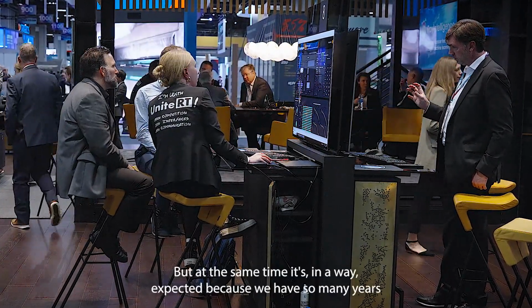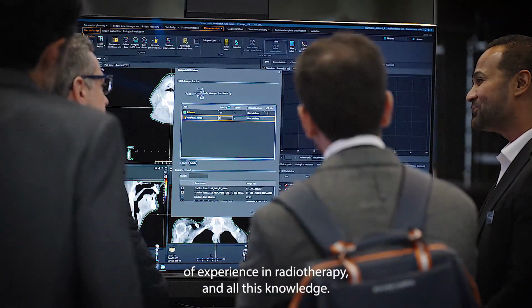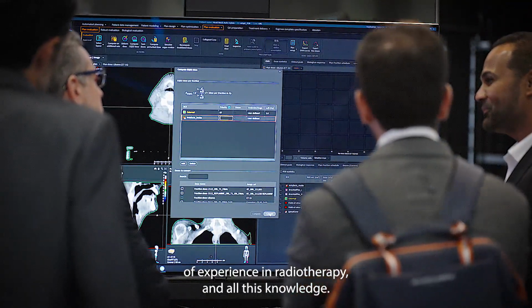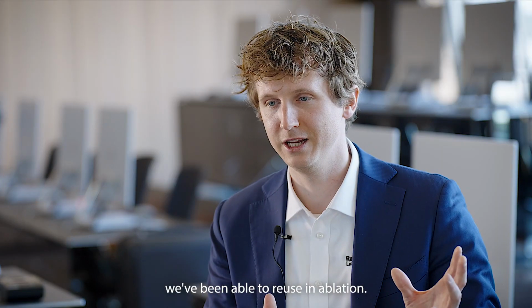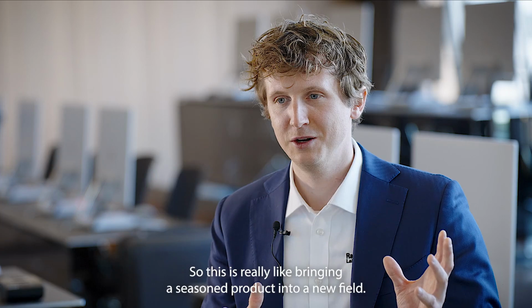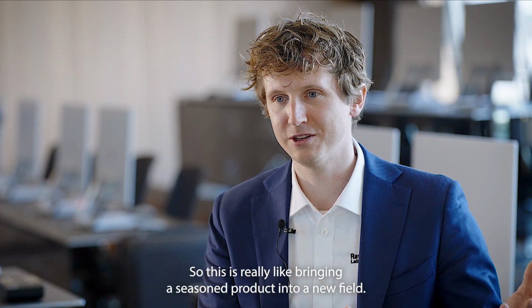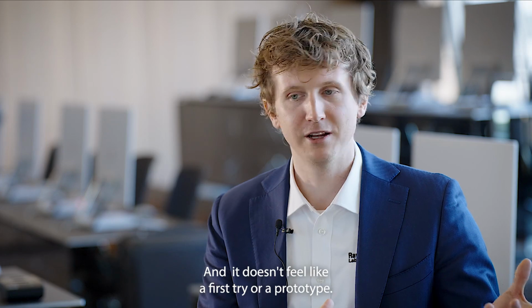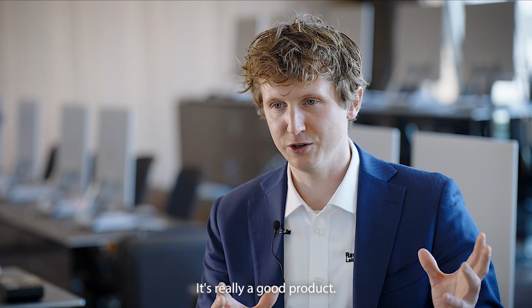But at the same time, it's in a way expected because we have so many years of experience in radiotherapy and all this knowledge, and even the software tools itself, we've been able to reuse in ablation. So this is really like bringing a seasoned product into a new field. And it doesn't feel like a first try or a prototype. It's really a good product.